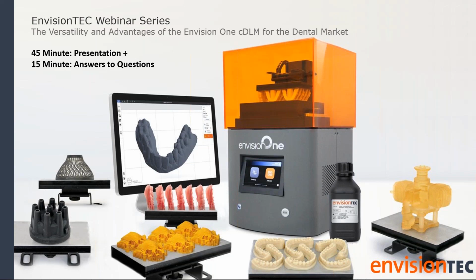Depending on the curing unit you have, some units are a little more hands-off, like the UBCA 1000. You lay your models out, close the drawer, there are lights on both bottom and top, you run it for 5 to 10 minutes, and it's very hands-off. It takes a little longer, but it is meant to be hands-off, versus the auto flash where if we run a cycle of 250, we have to flip them halfway and do another 250. So it adds maybe a couple of minutes of human labor, but it is a quicker process.